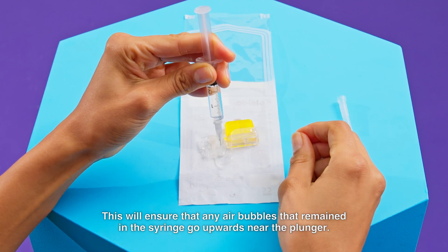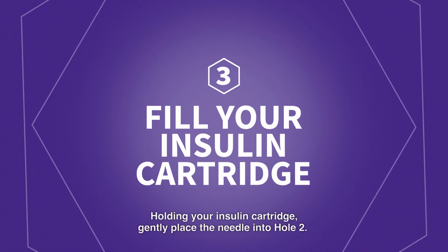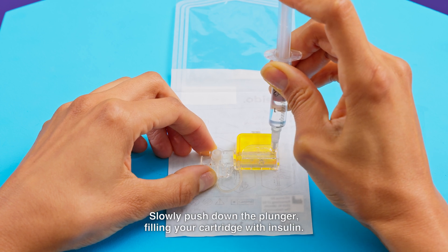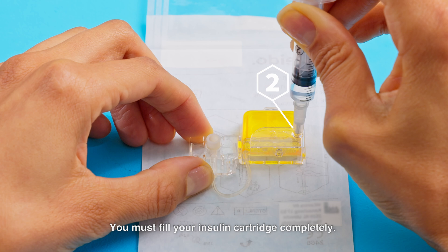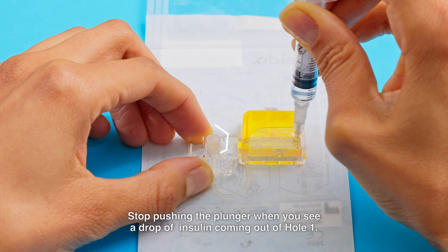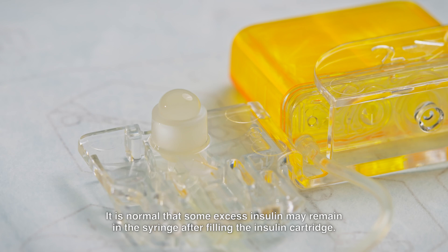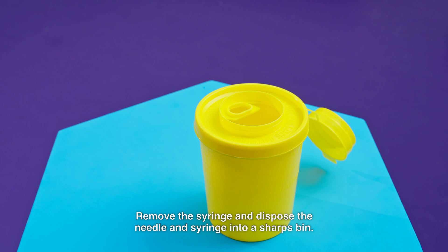This will ensure that any air bubbles remaining in the syringe go upwards near the plunger. Step 3: Fill your insulin cartridge. Holding your insulin cartridge, gently place the needle into hole 2. Slowly push down the plunger, filling your cartridge with insulin. You must fill your insulin cartridge completely. Stop pushing the plunger when you see a drop of insulin coming out of hole 1. It is normal that some excess insulin may remain in the syringe after filling. Remove the syringe and dispose of the needle and syringe into a sharps bin.